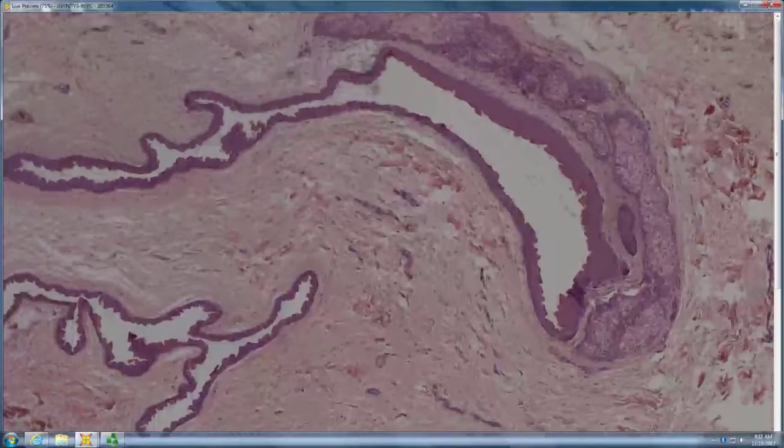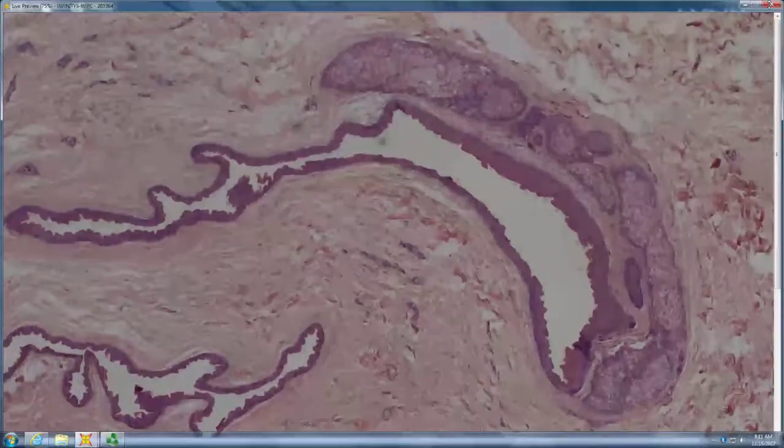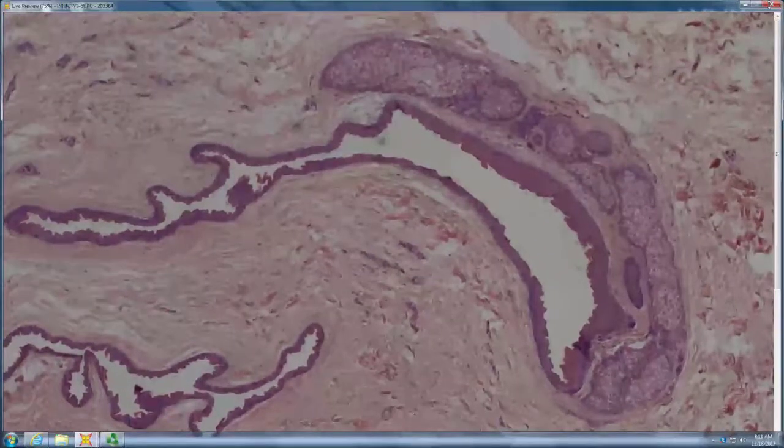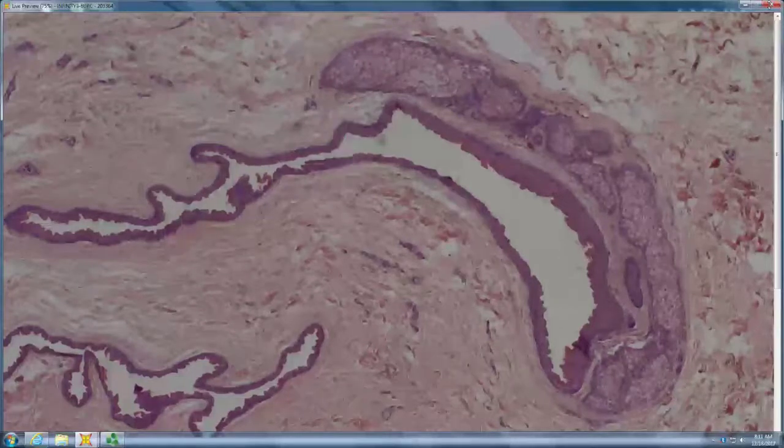Is this like a steatocystoma? Like a steatocystoma. You have the shark tooth lining and the sebaceous glands. Often they're filled with oil. They collapse. They have vellus hairs.